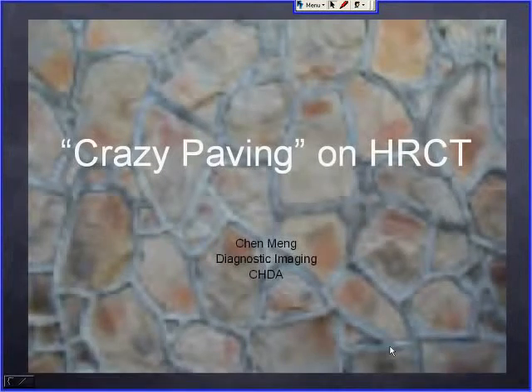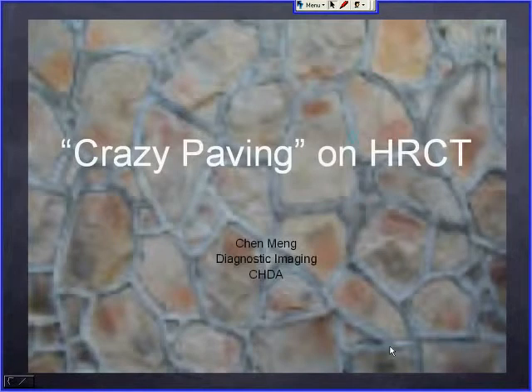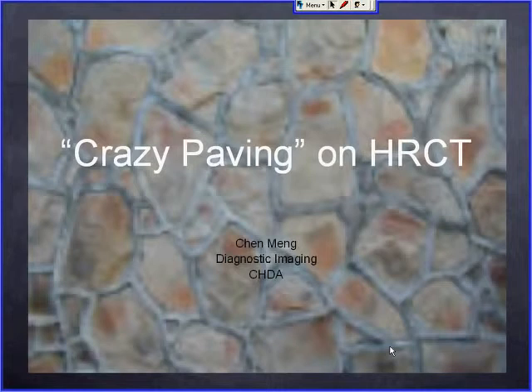Welcome to resident paper. Today I'd like to discuss briefly the differential diagnosis for crazy paving on high-resolution CT, as a continuation of my grand rounds.